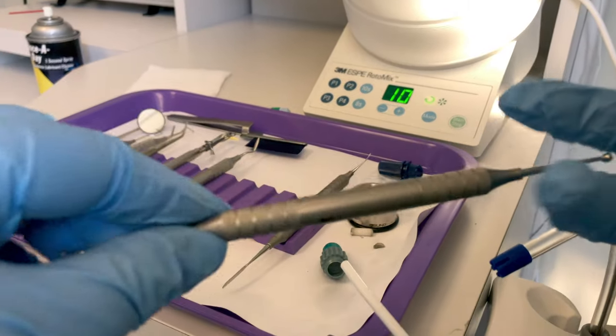You might pass the cleoid discoid and the ball burnisher back and forth a few times with your operator. Once the doctor is done carving and polishing the occlusal surface, because this is a proximal restoration, they will need to carve the interproximal surface. I just passed a Hollenbeck carver. Before they can get to the interproximal space, we have to remove the matrix system. Keep your finger over the occlusal surface of the tooth, loosen your outer knob, and pull the retainer off, leaving behind the band and the wedge. Use your cotton pliers to remove the wedge from the lingual side, then carefully lift your band up, being careful not to break out the restoration that was just placed.